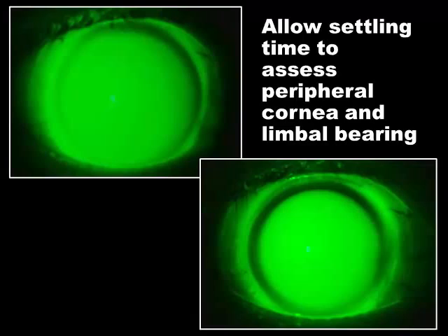And what we're concerned with is that lens touching down on the peripheral cornea, possibly rubbing on the peripheral cornea and creating that staining. So anytime you see this thinning or this bearing through more than 180 degrees, you're going to want to call up the lab and order up a limbal clearance zone +5. You're going to want to increase the limbal clearance.